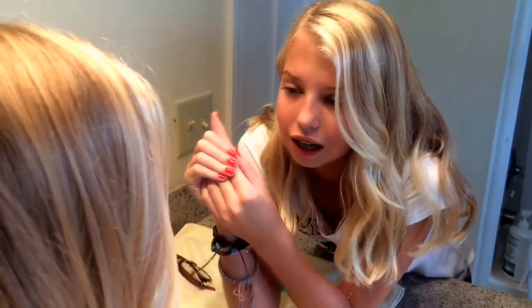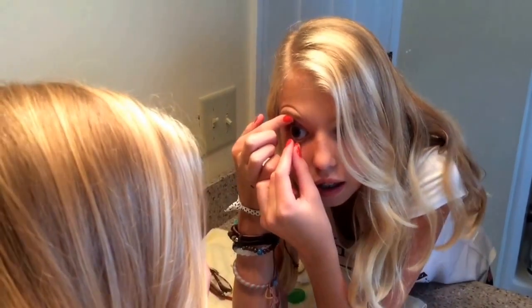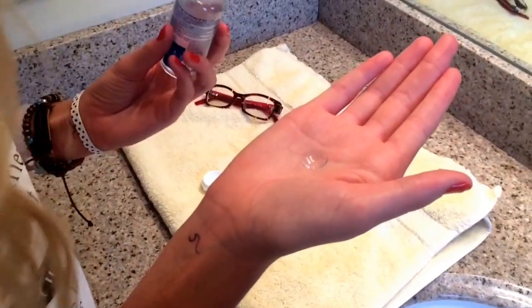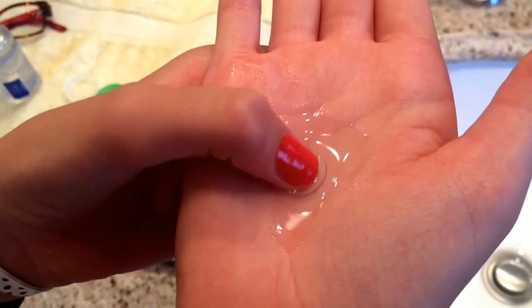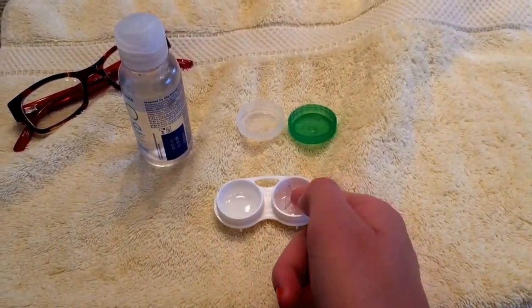To easily take your contacts out, use the pads of your fingers and open your eyelids to make it easier to take them out. Now I'm going to rinse my contact out with the solution. Gently rub the contact to get a good cleanse.